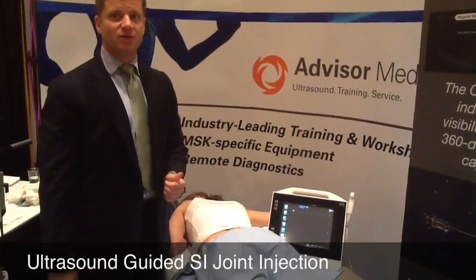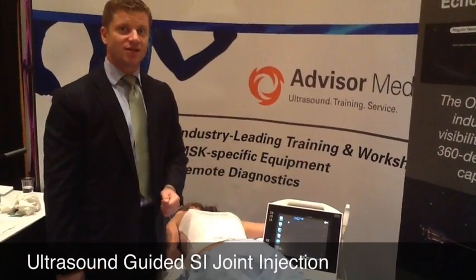Hi, I'm Paul Kamping. I'm going to show you how to do the sacral iliac joint injection under ultrasound guidance.